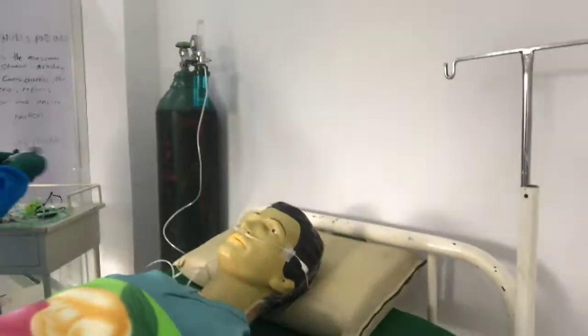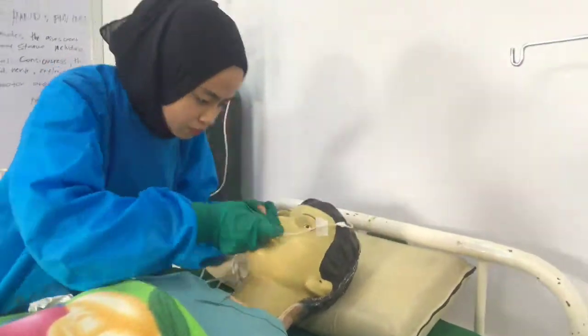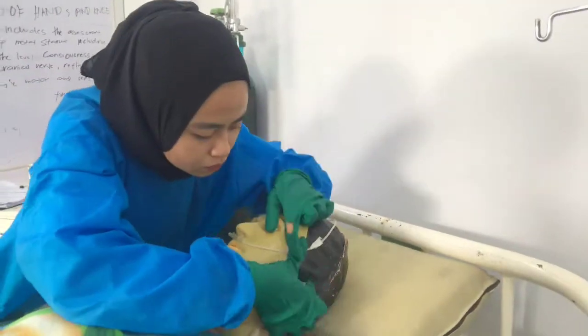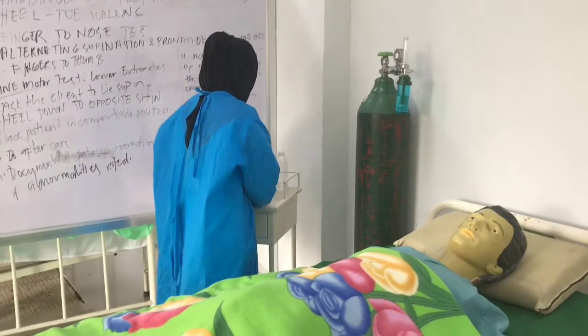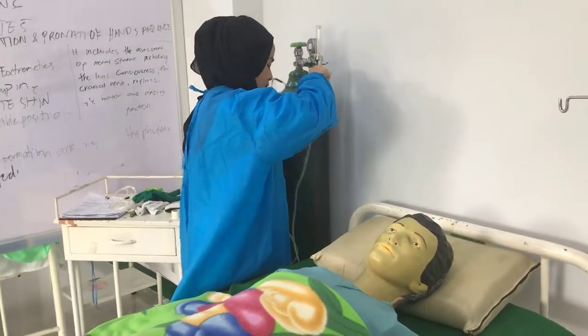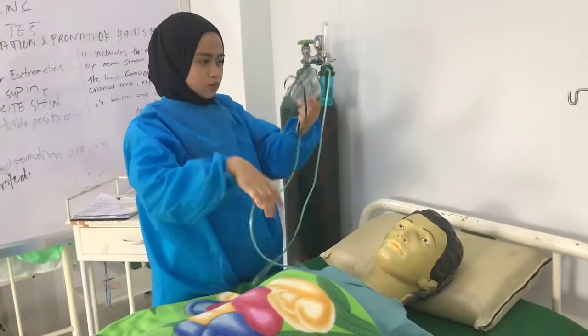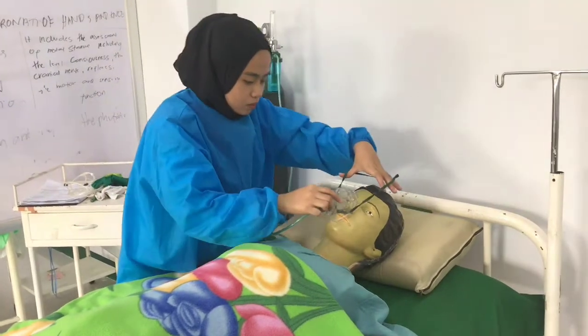Inspect nasal prongs for presence of nasal secretions or crust. Wipe the prongs with gauze pad as needed. This is to promote comfort and maintain hygiene. Using face mask. Guide the mask toward the client's face and apply it from the nose downward. This is to place the mask comfortably without irritating the client.